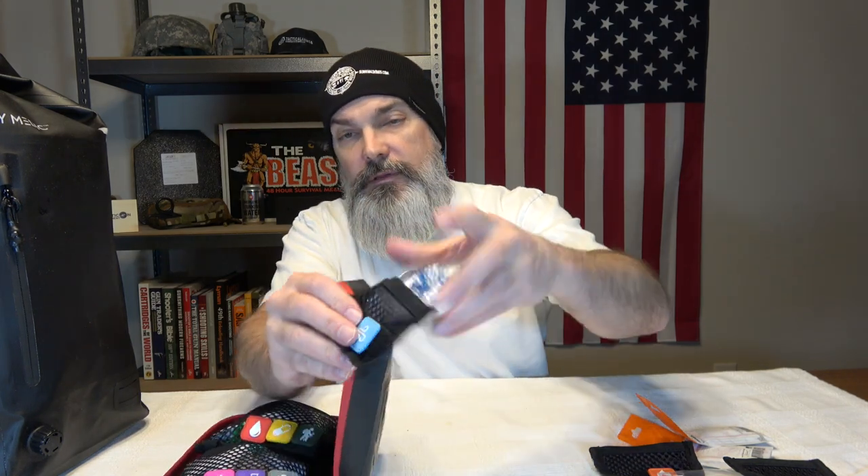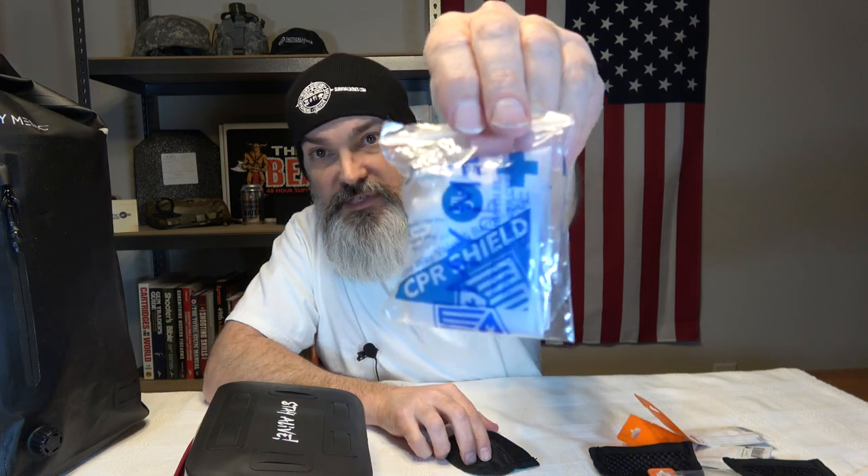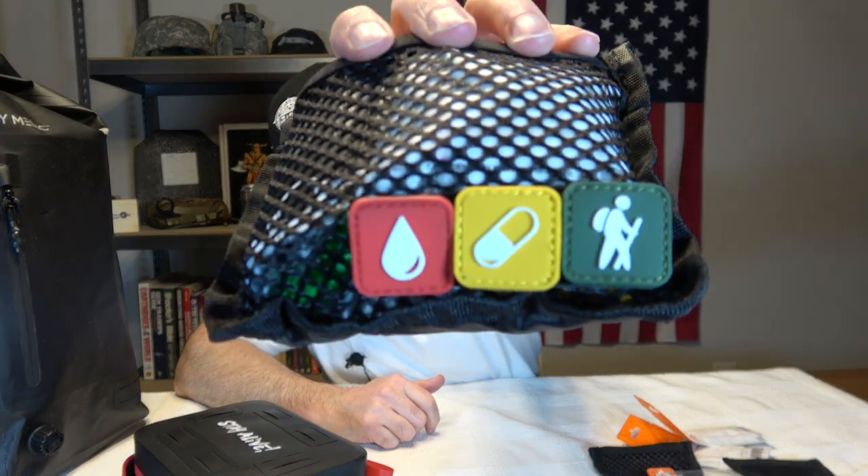Then we've got one down here that has a little white wind-looking icon on it. This is an airway bag — a CPR shield. So this one has a CPR shield for your airway. And then we've got two big compartments. This one has a little hiking figure icon — I'm guessing this is going to be for blood and closures. Like a safety pin. Let's see what's in this one.